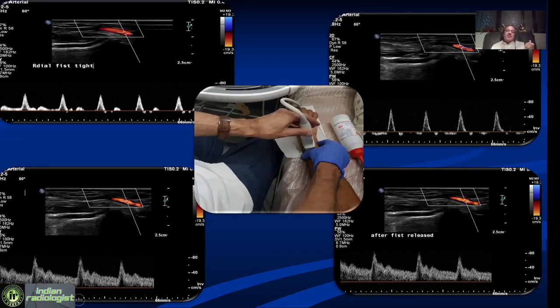Here we are demonstrating this: the patient is looking at the radial artery, the fist is very tight and we can see there is a high resistance — in fact there is a reversal of flow. After releasing the fist, there is a reactive hyperemia and we can see an increase in diastolic flow. This is a normal response.